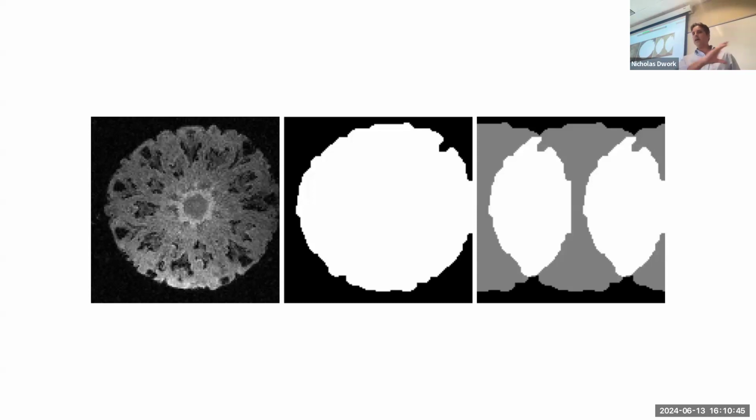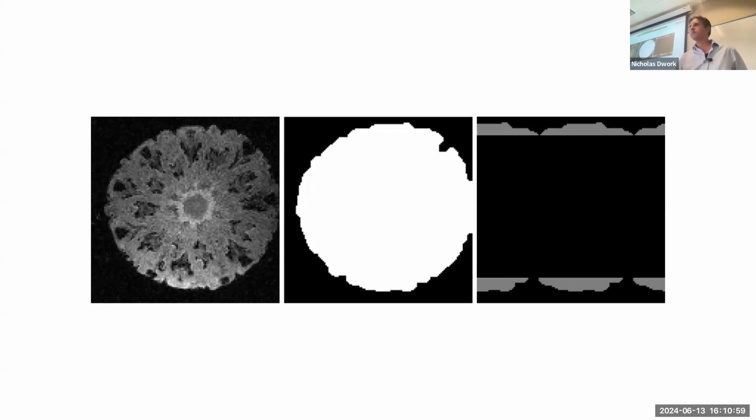Now I'm gonna remove any row where the aliased image overlaps itself. And this we know just from the support. We don't know anything else, just the non-rectangular field of view, the boundary of this white region. So I'm gonna eliminate those rows, okay? Now I'm gonna intersect that result with the non-rectangular field of view. That gives me this. So this is the pristine part of the image after I only use every other column to reconstruct.